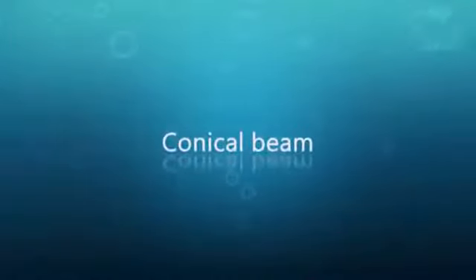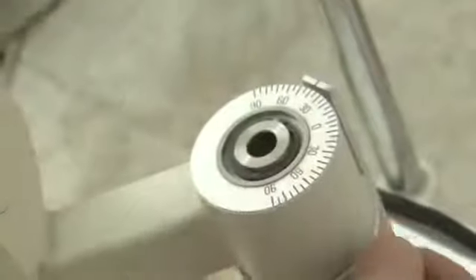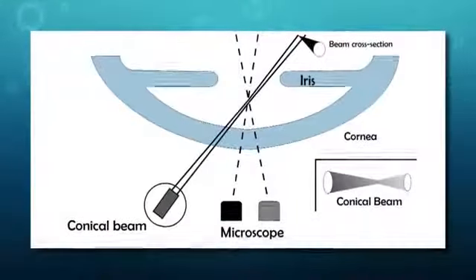Conical beam. First, set the angle between the light source and the observation system at about 45 degrees. The light source intensity is set on high. Dim the room light, magnification set to high. Adjust the light source aperture size to the smallest one, or reduce the height of a parallelepiped until it becomes a small spot.